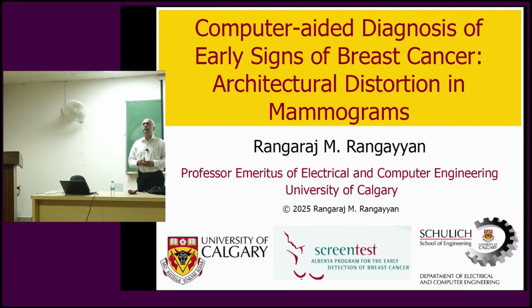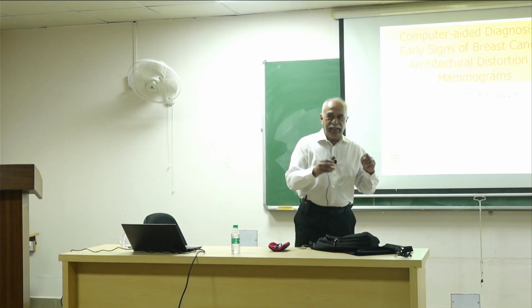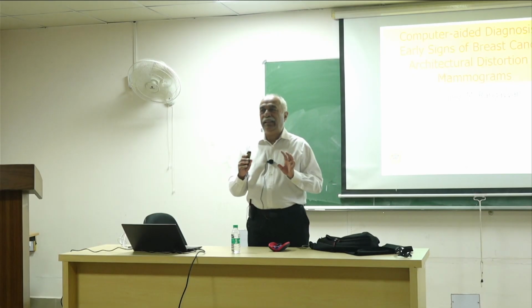So there have been many studies that have shown that a radiologist plus CAD is almost the same as a radiologist plus another radiologist. So you can cut some costs if you have a computer to assist a radiologist instead of the films being interpreted by 2 radiologists that was required before. Every case had to be interpreted by a minimum of 2 actual radiologists in a screening program. And then they replaced the second radiologist with a CAD system. And there have been many, many studies to show that this works reasonably well.